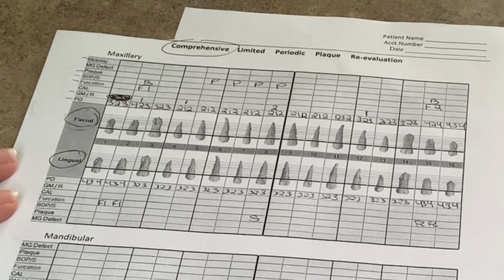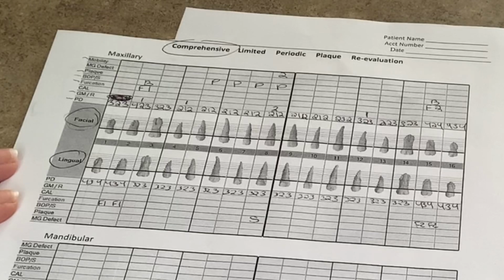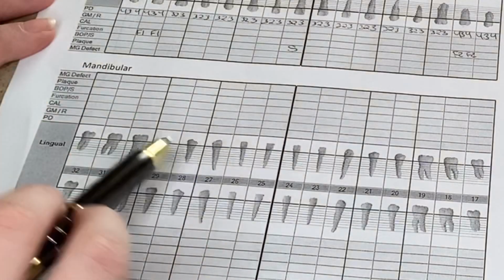Now the next thing we're going to do is the mobility. So again, that's how loose a tooth is, and the hygienist will give you that reading. So number 8 has a number 2 mobility. Number 9 has a number 1. And then you would go down to the lowers to finish that with the hygienist.